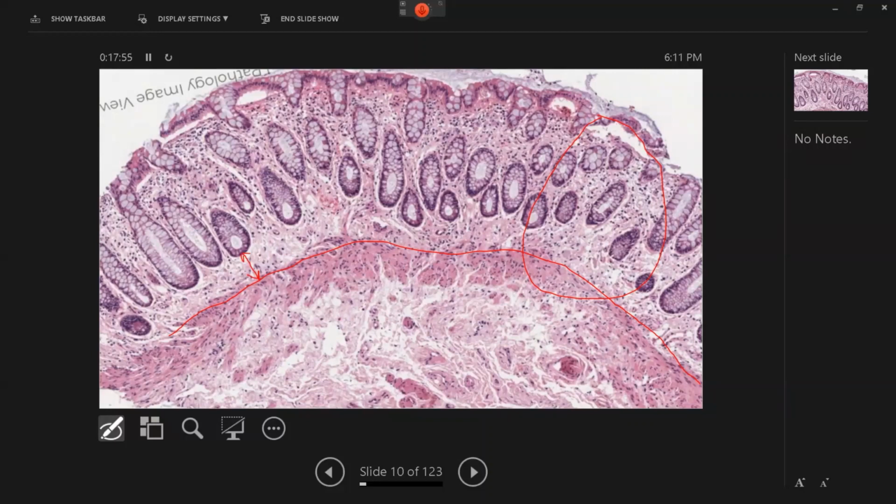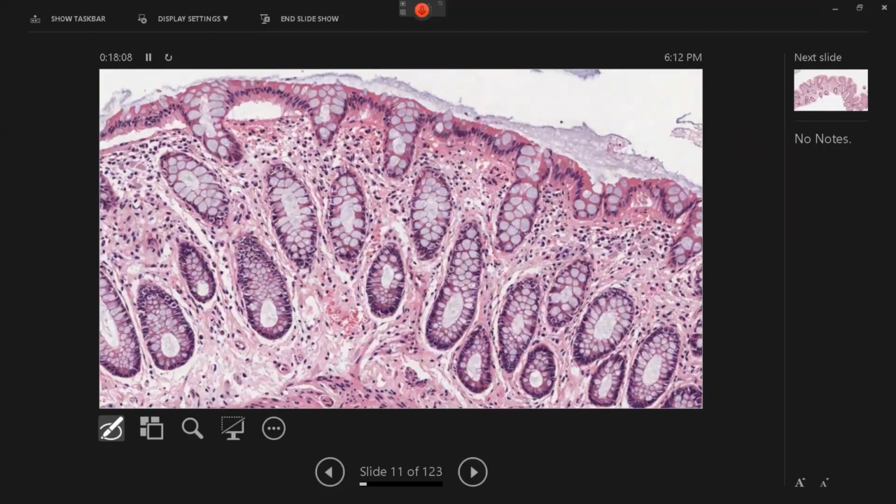So if we think of these features properly, then there is definitely a crypt shortening, which you are able to highlight, and you are able to see that most of the crypts look slightly flattened.